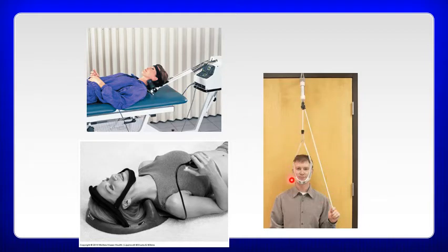In this case, you can actually put a little bit more than 25 pounds, because you obviously have to account for the weight of the head when they're seated. So you have to make sure that you account for that with the over-the-door units, but even though they look a little strange, they're pretty popular to use.